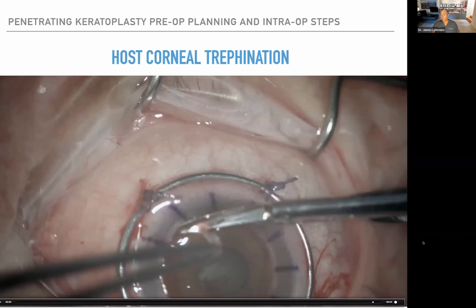Dr. Zahra Ashena asks, what extra steps do you take in perforated corneas prior to trephination? That's a great question. You can still do vacuum trephination on a perforated cornea. It'll still stick. What I like to do is inject a viscoelastic through the perforation, and in that case, I'd probably use a dispersive viscoelastic that wasn't going to expel so much.